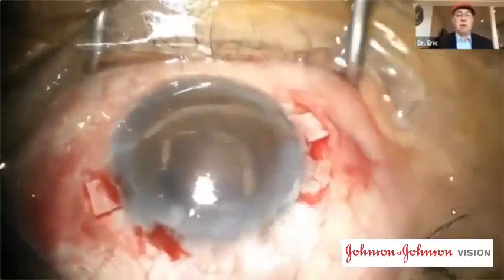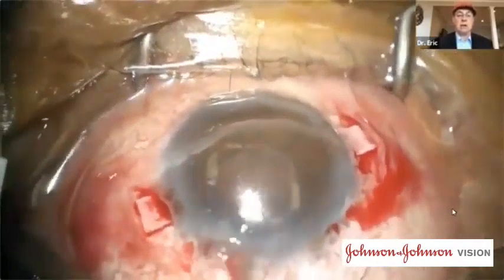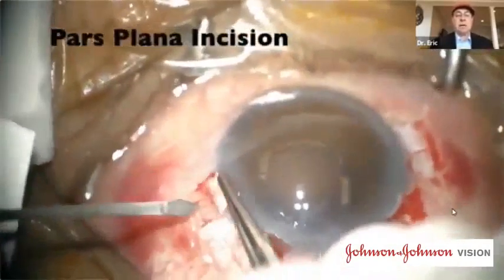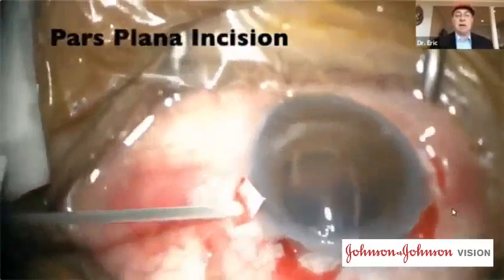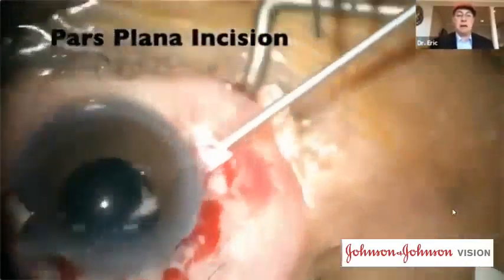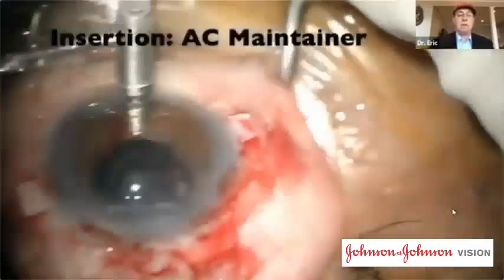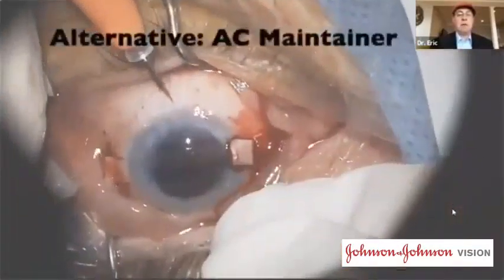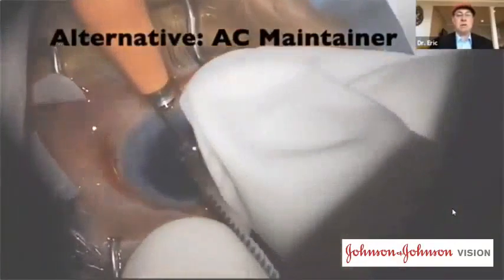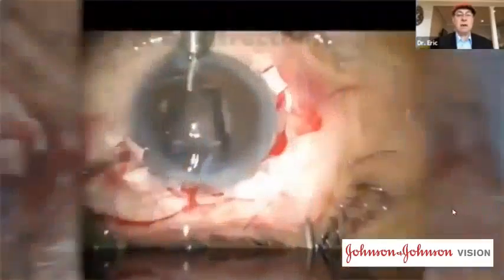It's very important to realize this is a small incision surgery. I apply viscoelastic. I usually place a dispersive viscoelastic. And then I take the MVR blade and I enter the eye going straight backwards so I can see the tip of the MVR blade. I place my trocar. I like this one, but the one I like best is the one that Amar developed, which is a sleeve trocar. Inserts very nicely. And then hook up my infusion.